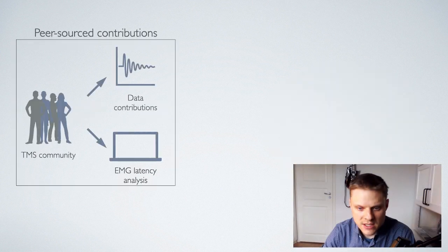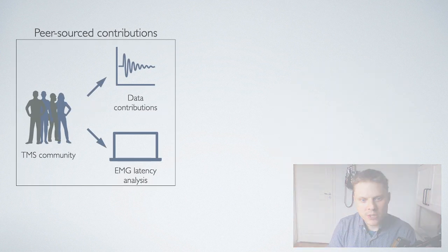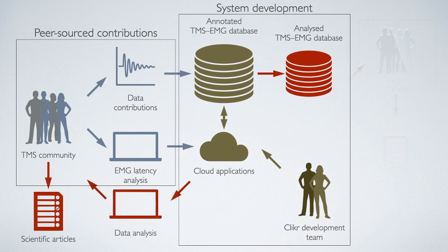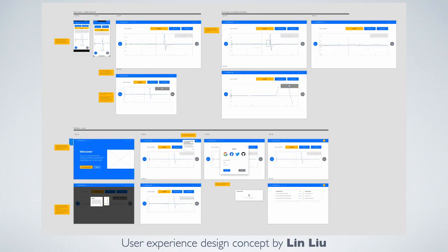My aim in this presentation has been to show you that we have developed a system that provides a unique opportunity for the TMS EMG community to support each other, provide new opportunities for research, and advance the science in this field. Currently, we have a working prototype of the system running, which you can go and take a look at. The link is in the last slide. We have a small example dataset running, and we are currently revising all of the front-end software. Unfortunately, the new interface was not ready for this presentation, but if you check in a few days, it should be available.